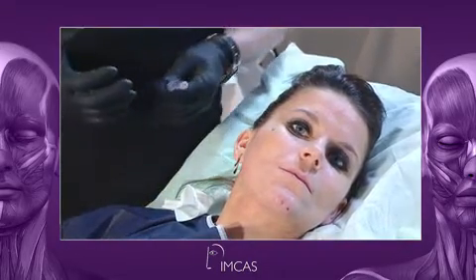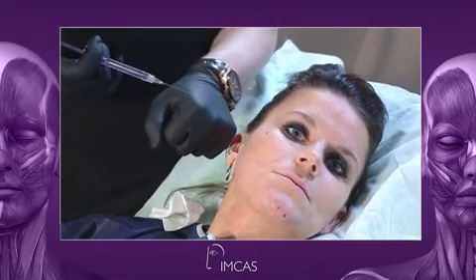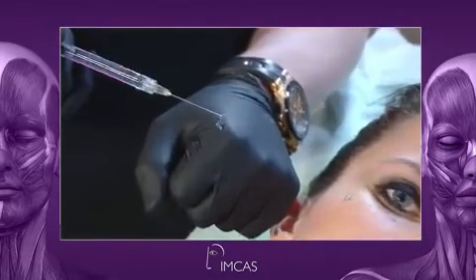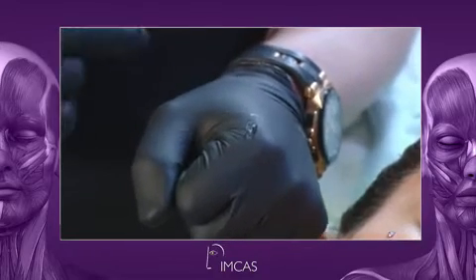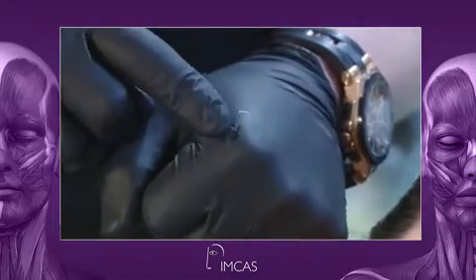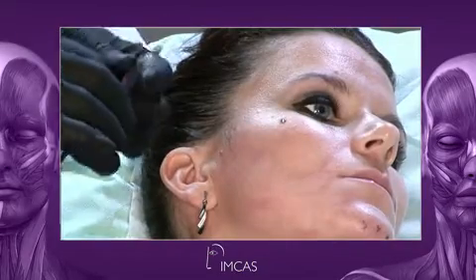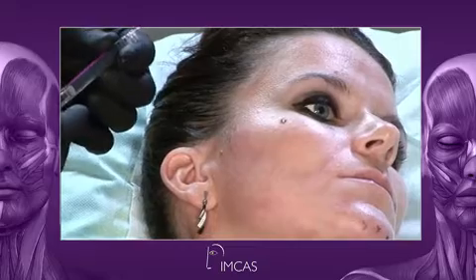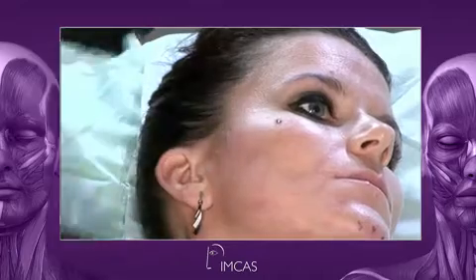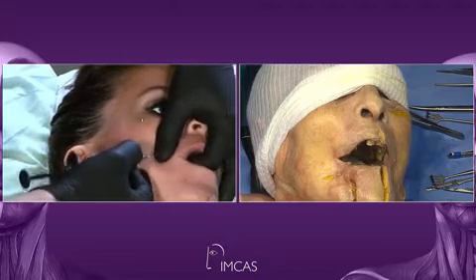So what are the things that we need to consider when we choose a gel for the lips? For me, I don't know any patients looking for hard lips. Everybody wants soft lips, right? But on the other hand, the lips are constantly moving, so we also want the gel to stay there, and we can choose a gel with a higher cohesivity. So what we want is soft gels with high cohesivity. And this is Emervel Lips, and it has a low calibration, meaning it's quite small particle, but it's higher in cross-linking and more cohesive as a gel, so it will not move around in the same way. So this is one of my favorites for lips, and of course there are many good products out on the market.